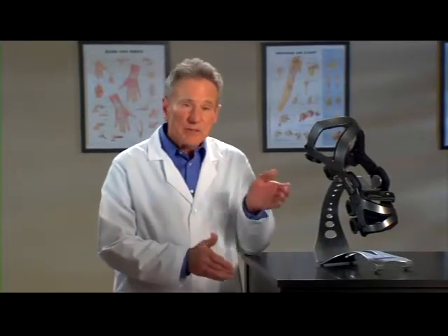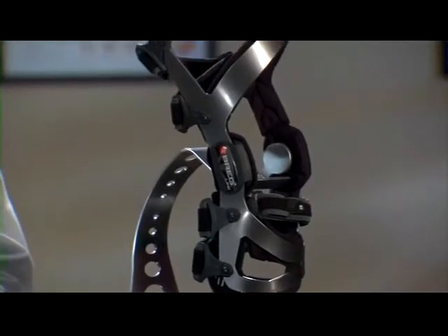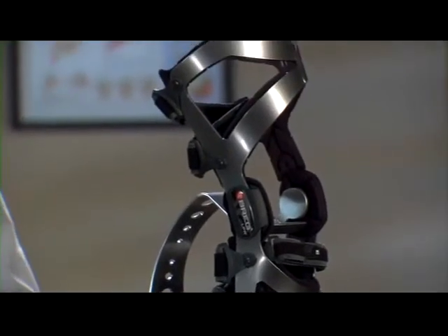Hi, I'm Jim. I'm here to tell you about the brace chosen specifically for you and your condition. It's from Bregg and it's called the LPR Knee Brace. You'll be wearing this brace because the LPR is designed to protect your knee by providing rigid support and stability.